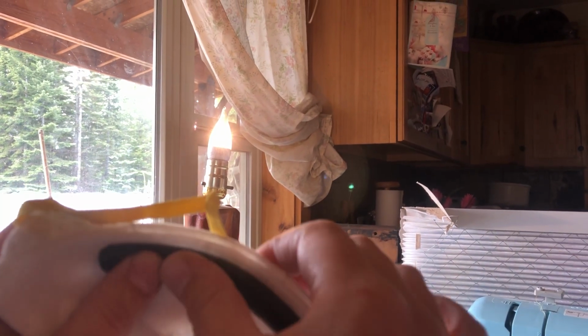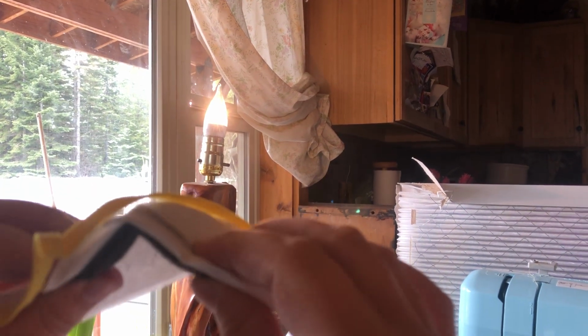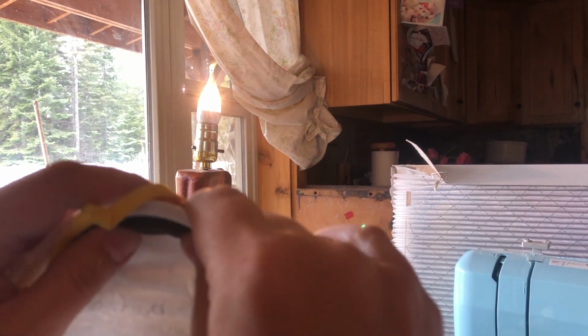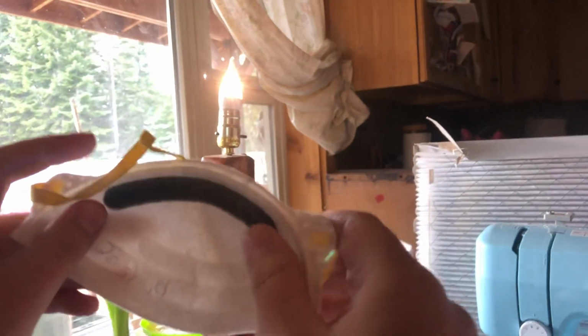And then this nose piece, this makes it to where it doesn't hurt, with this metal piece coming down over your nose and shaping to your face. Now, if you don't shape this to your face and you've got air coming through the sides, this mask isn't doing what it's intended to do. It's supposed to keep the stuff coming through the mask and not around the sides. So that's our N95 dissect.